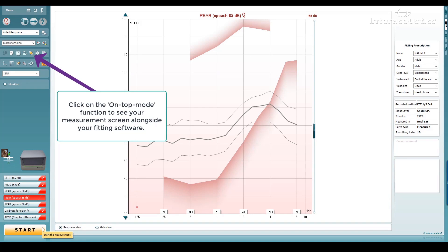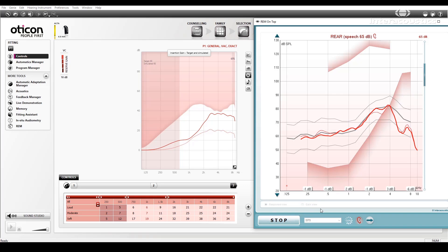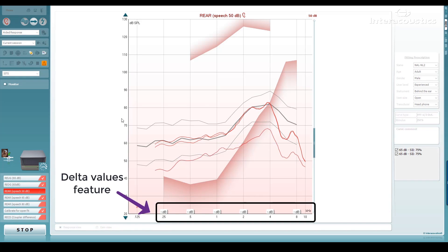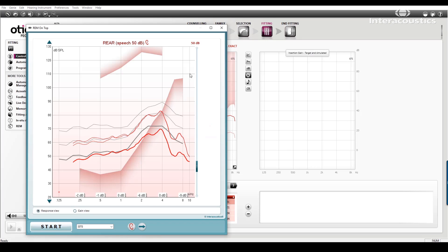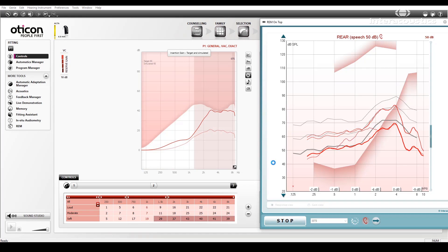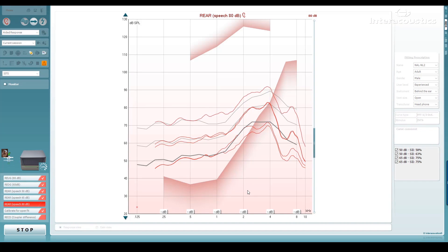Finally, you can move on to your aided measurements and your target match. Switch on the hearing aid and begin to fit it. It's advised to run three different stimuli levels: 65, 50, and 80 dB. This ensures that you're assessing the hearing aid at different levels of intensity. On running the different stimuli, you should alter the gain trimmers in your hearing aid software to ensure a good target match. You can use the delta values feature in your Affinity Suite to ensure a good target match. Once a sufficient target match has been achieved at all three levels, the objective aspect of the fitting has been completed. You should now move on to counselling the patient surrounding the amplification and include their preferences within the fitting.